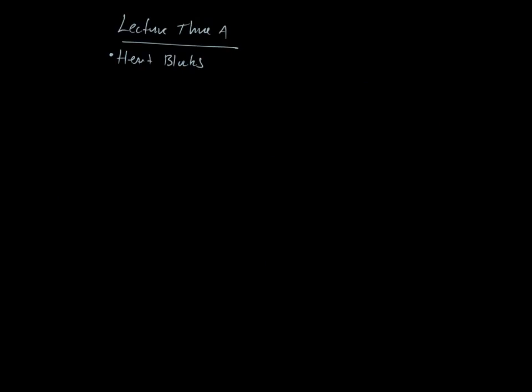Okay, and we talked about the heart blocks. You have a first degree AV block, and what is that? PRI is over 0.2 seconds. And we always identify the underlying rhythm, right? So sinus rhythm with first degree AV block, sinus bradycardia, sinus tachycardia, whatever. You guys okay with that?